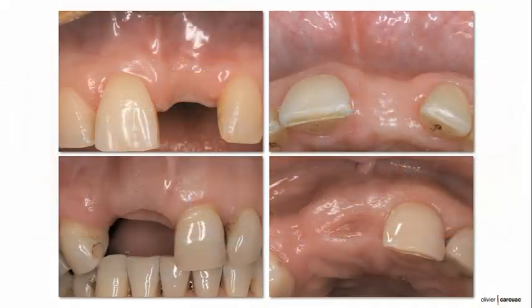Implant therapy in the anterior maxilla is challenging for the clinician because of the aesthetic demands of patient and difficult pre-existing anatomy. In this aesthetic area, the clinician is often confronted with tissue deficiencies caused by various conditions.